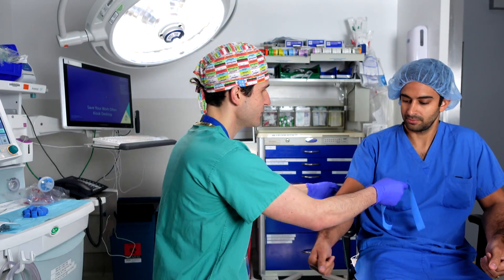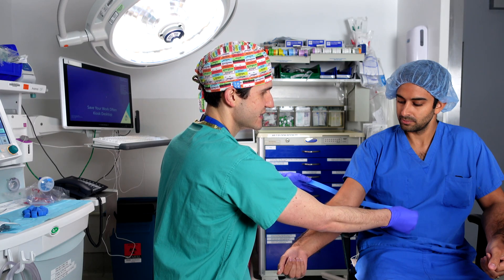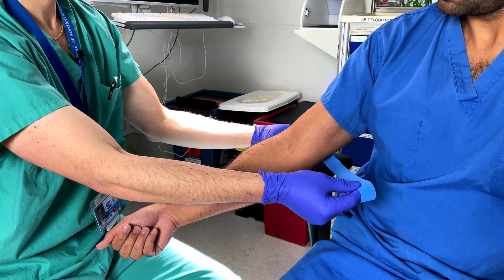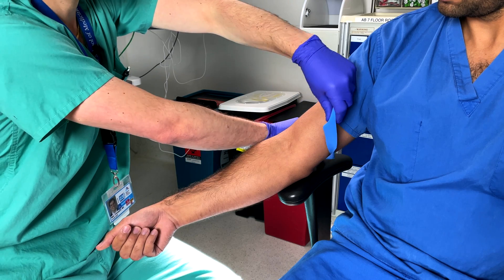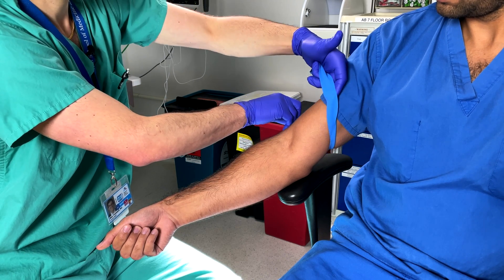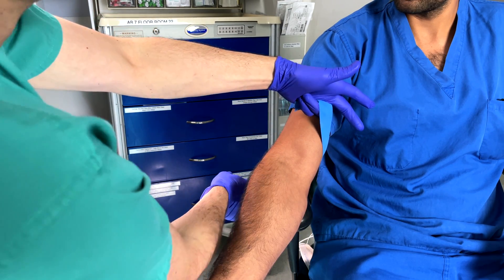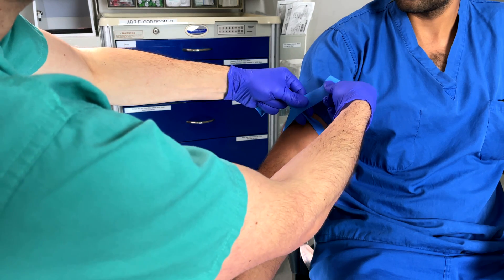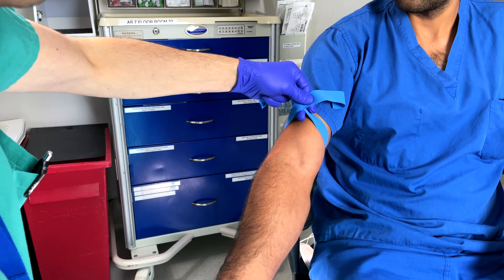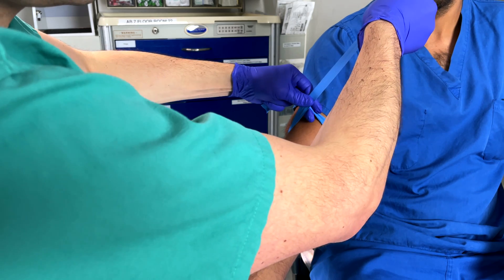With those goals in mind, the way that I start is by placing the rubber band under the patient's arm. In this case we'll be placing the tourniquet on the upper arm, so you can see that it runs just behind his arm like this. With the tourniquet behind the patient's arm, I reach across with my left hand and make this the back side of the tourniquet, securing it in my left hand with my fourth and fifth digit. That allows me to use the other strap and place it between my thumb and index finger using just my left hand.